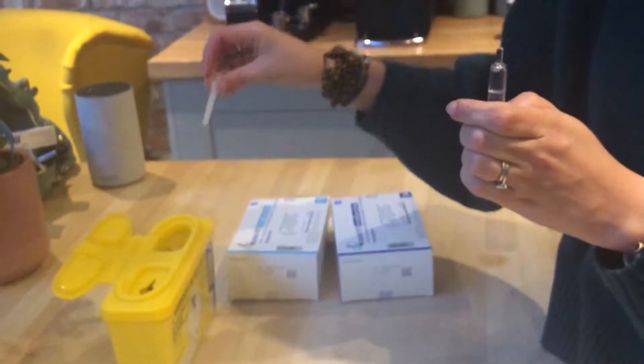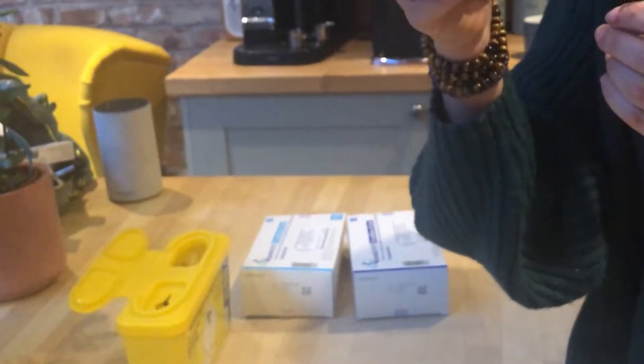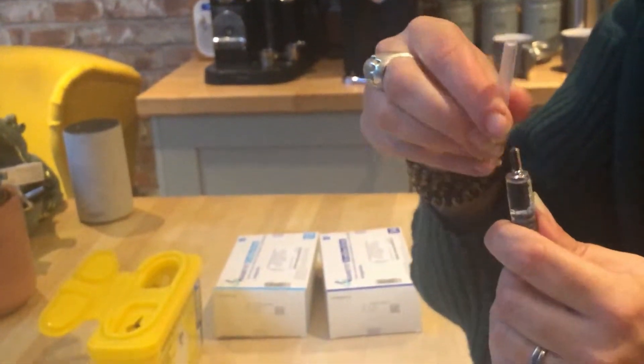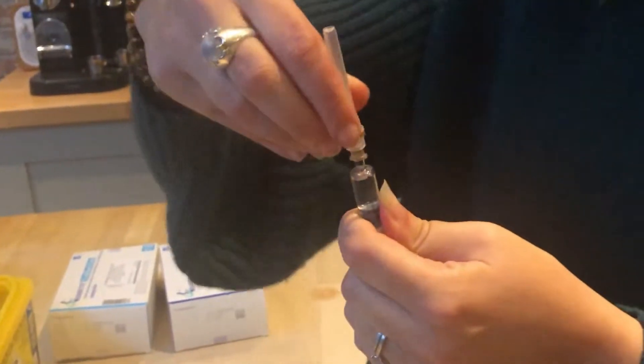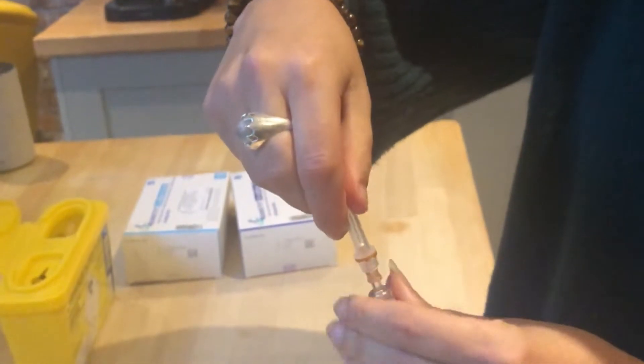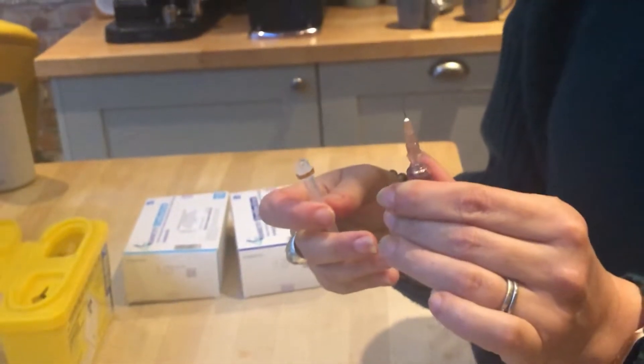Then you put your sheath back on, and then we're going to change to the small needle. That's in there — just put that on, make sure it's on, give it a twist. Hold the bottom, hold the top, twist. And then you'll see this needle is much smaller.